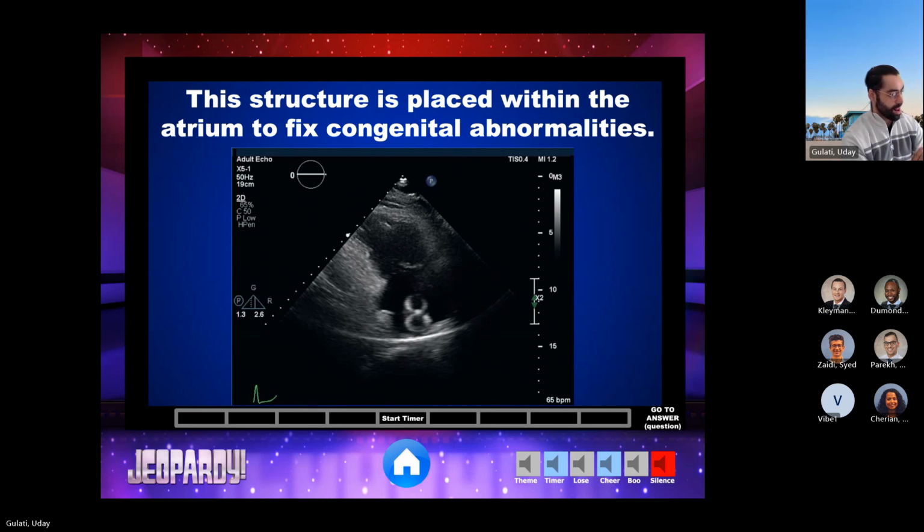A look. Is that a mitral clip? No. Quite. Oh, then it's okay, something else. Right? Anybody else care to guess? Is that a Watchman? No. Damn it. An ASD.